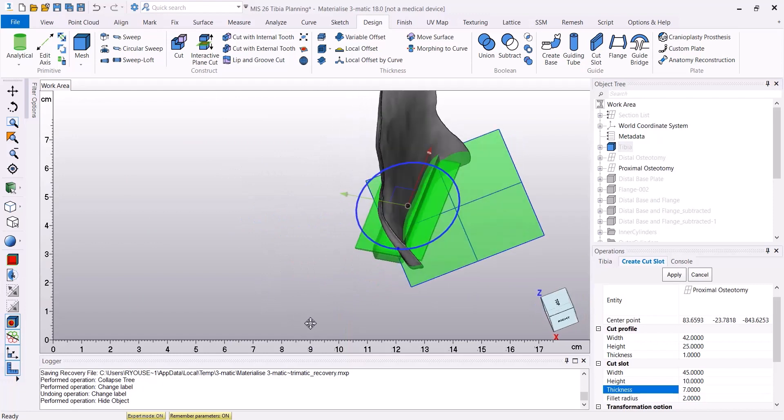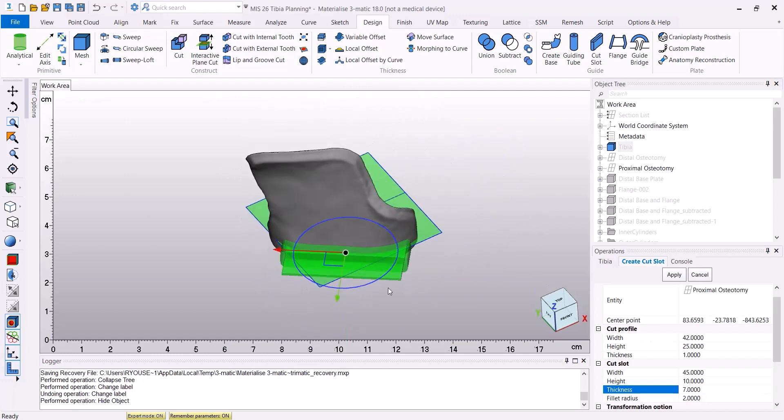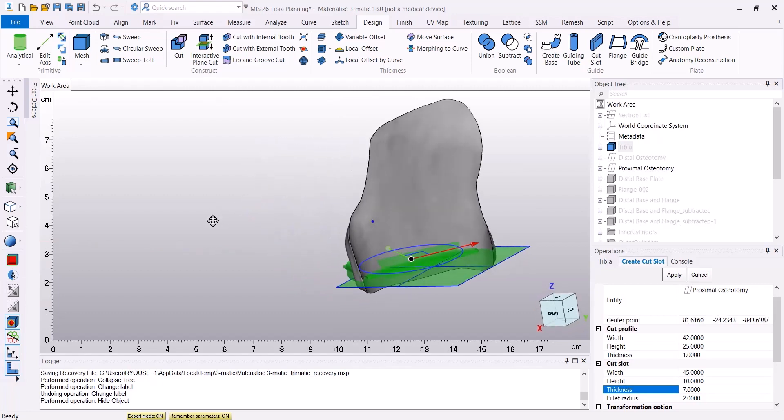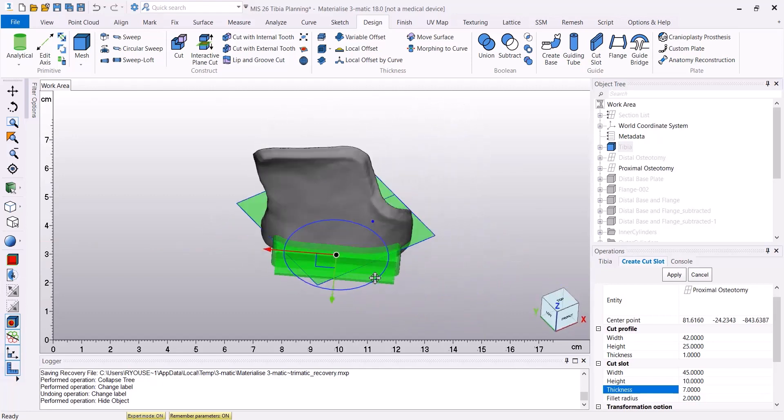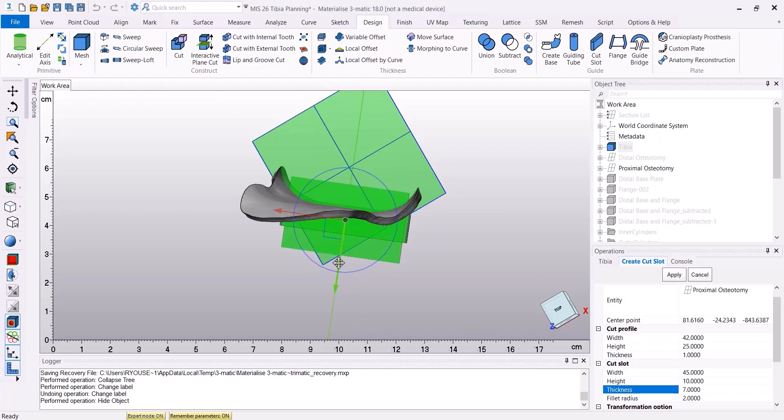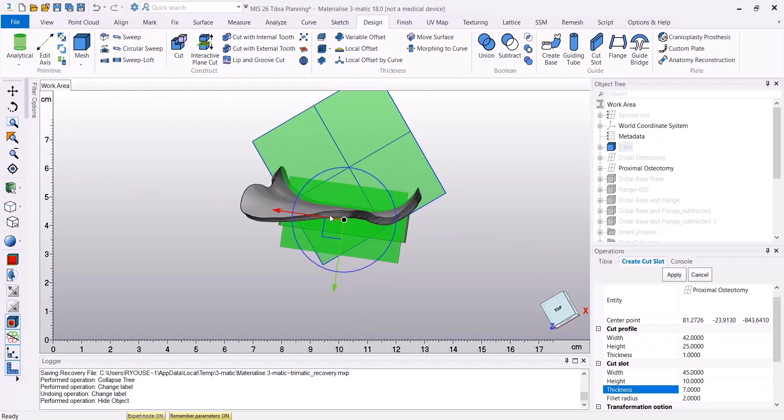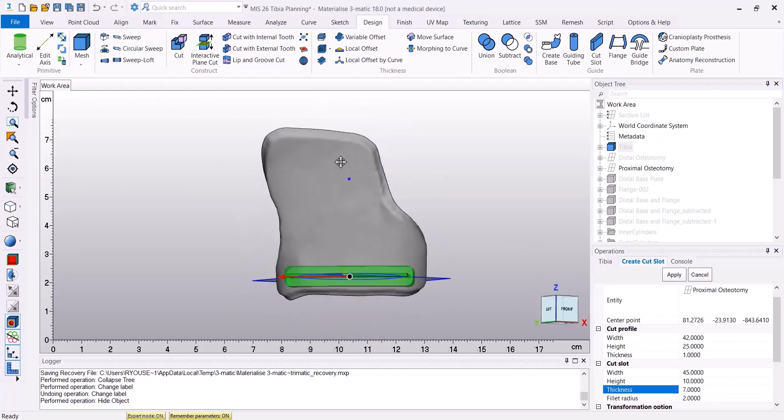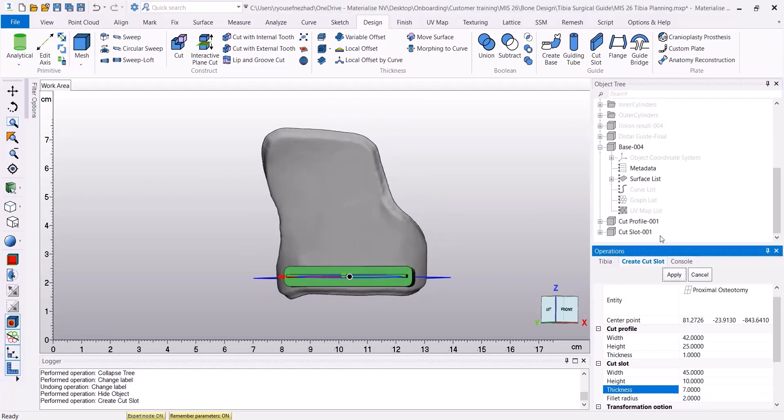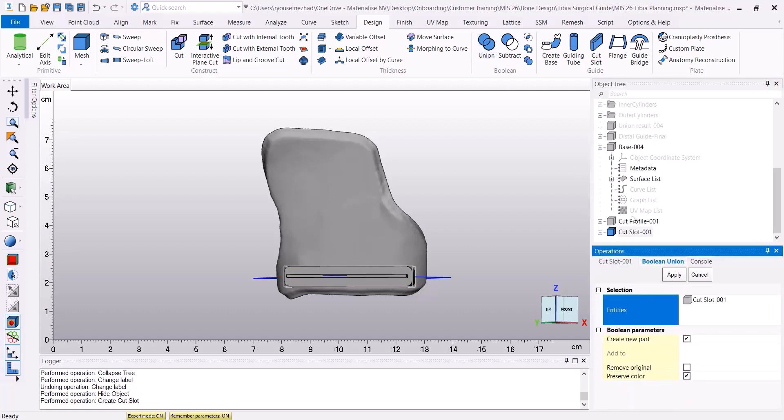Now, I'm going to make sure that the cut slot fits perfectly on the surface of my base by moving it around interactively before clicking on Apply. After I'm happy with the position, I can click on Apply. And as a result, I'm going to have two new objects in my object tree, the cut profile and the cut slot.